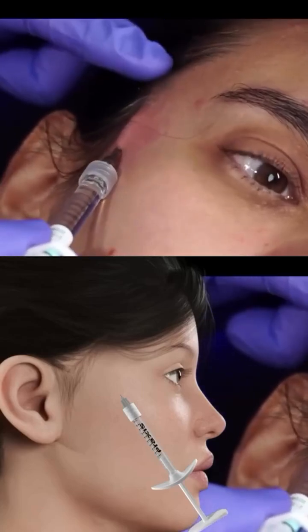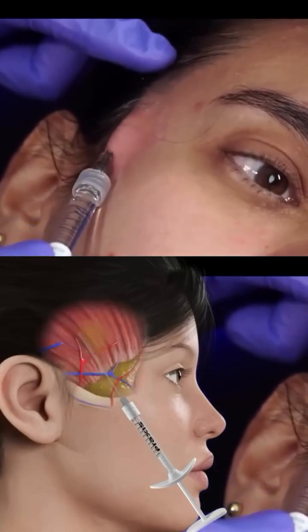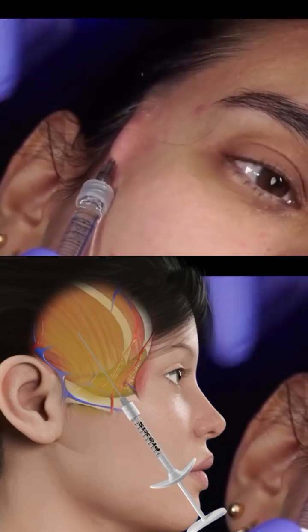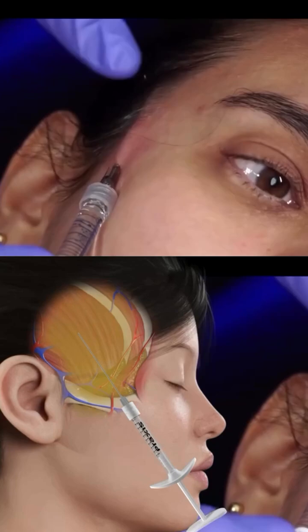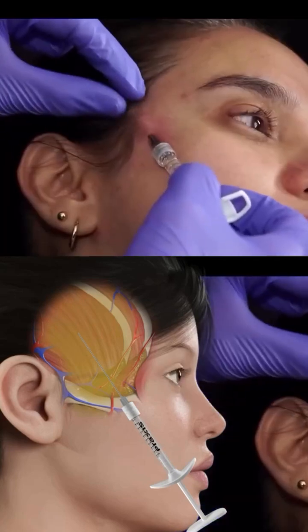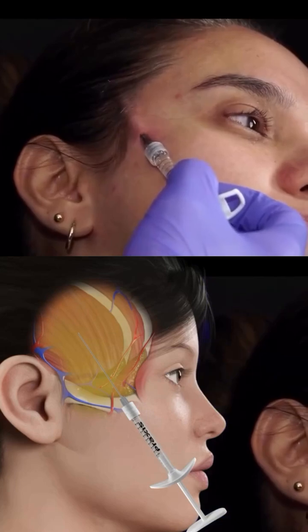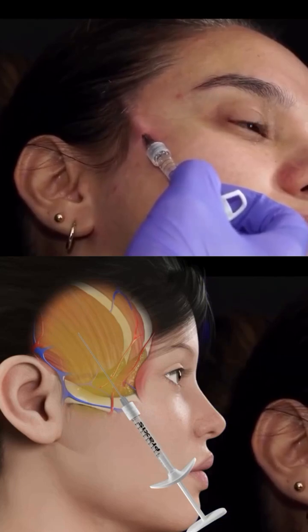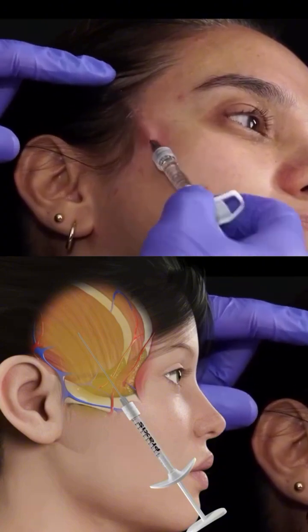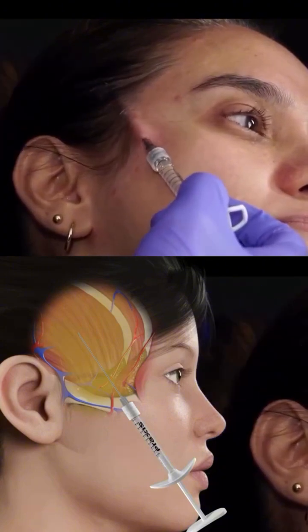When we do our temporal lift, we place a small bolus of product inside the scalp at this level. I am vertically above the zygomatic arch in the superficial fat layer of the posterior temporal region and in the correct plane.